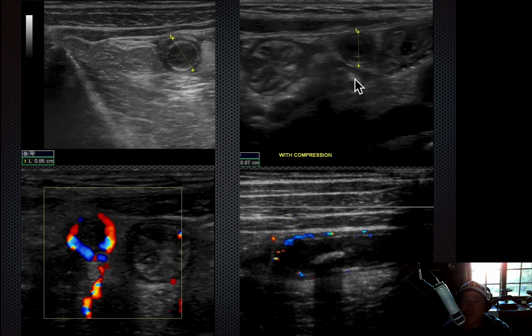They're saying with compression you can see, maybe that's psoas there. I'm not sure. That's definitely TI. I mean, look how beautiful those little petals are that come out like that. So you see that, it kind of looks like a sand dollar, actually, now that I think about it. Yeah, and all things Maui themed, this does look like a sand dollar to me.